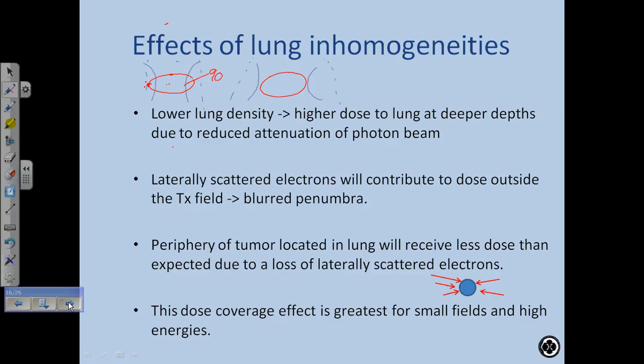Of course, you also get to a limit. If you're prescribing 100% to the periphery of the tumor, now you're happy you're covering it, 180 a day to the whole tumor, you might be delivering 130% on your hotspot. And that's kind of high, 30%. So then you reach limits. And when I say 130, it sounds bad, but remember, we always have to talk about dose. So if he's delivering 180 a day here, and his hotspot's 130, what is that, approximately? 54 above, so that's 234 a day.